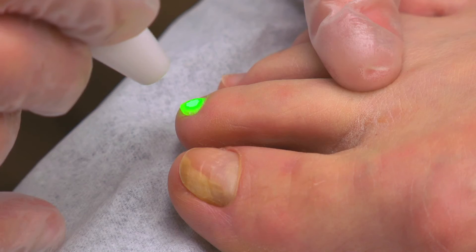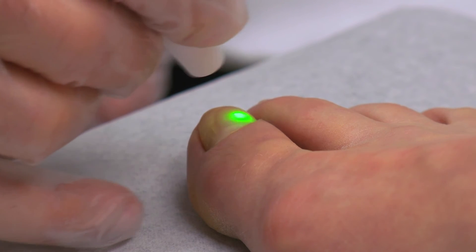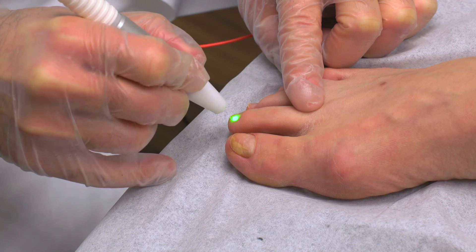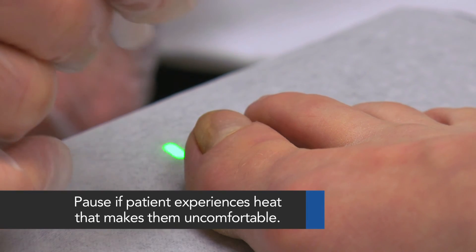Give the treated nail time to cool by moving on to the next and repeating this grid pattern. For the typical big toe, the laser must reach approximately 500 joules, and 80 to 100 joules for a typical small toe on each pass. If the patient experiences too much discomfort, pause longer between passes.